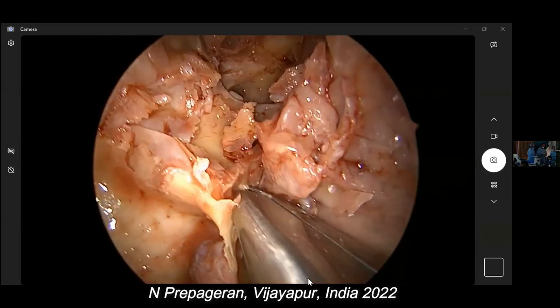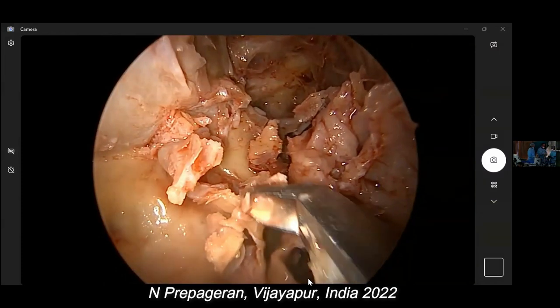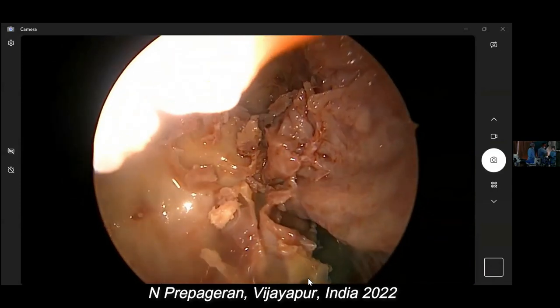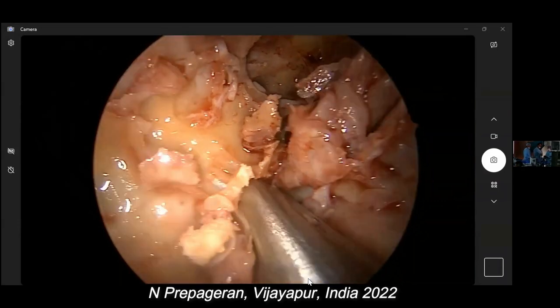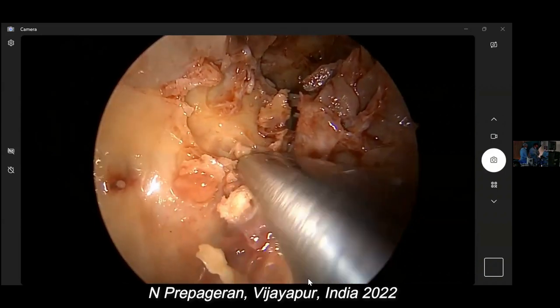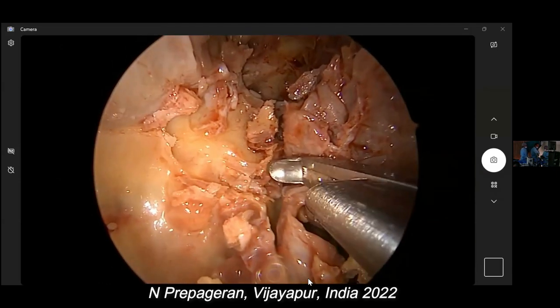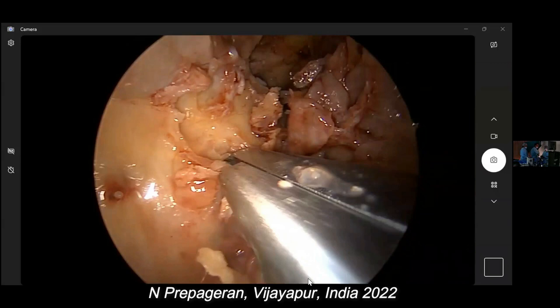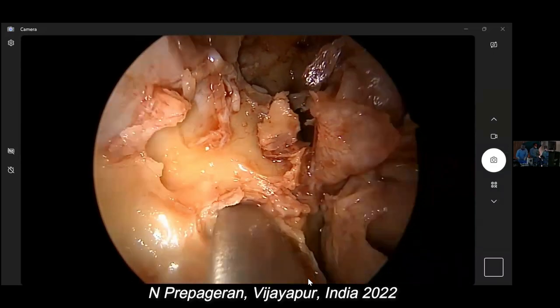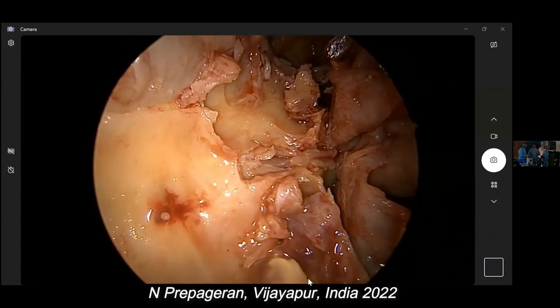This is the fifth instrument you are using, sir. Kerrison punch. Yeah, I'm just using the Kerrison punch. Okay, so now I am going to follow the SPA backwards and open up the posterior wall of the maxilla. There we go. Can you see? So now, can you see the artery there? Okay, there's the artery there. Okay, Kerrison punch. Oh, sorry, what am I saying?